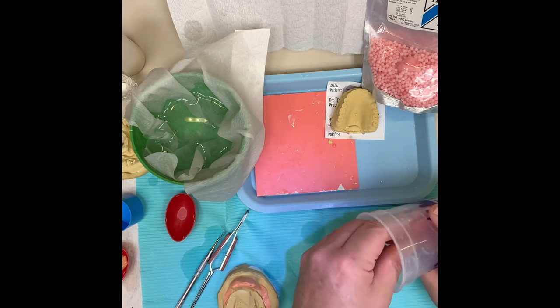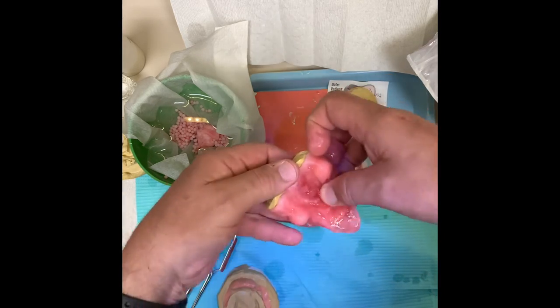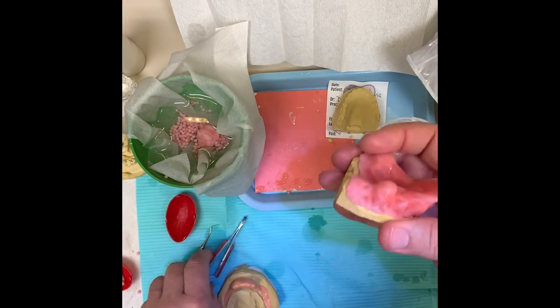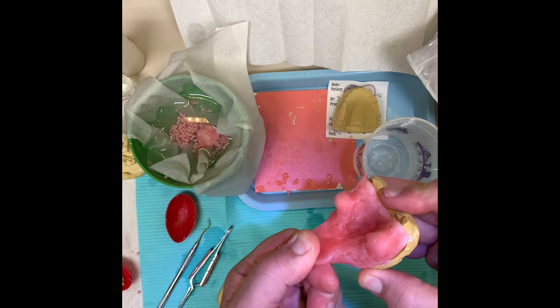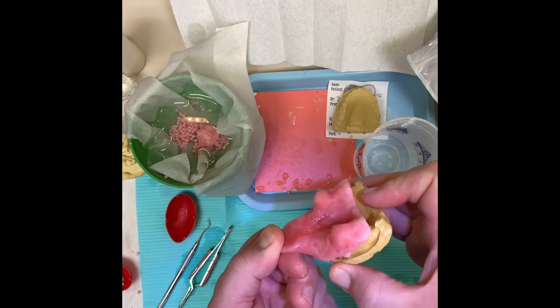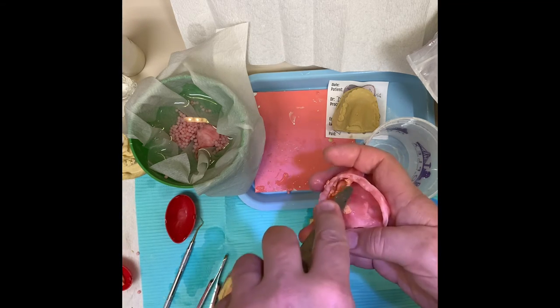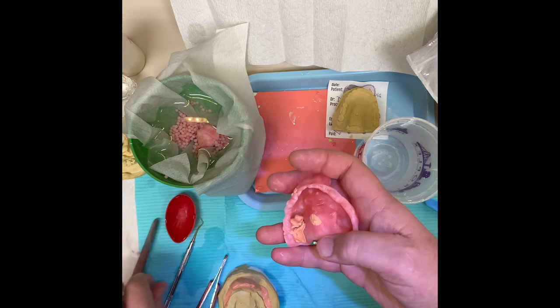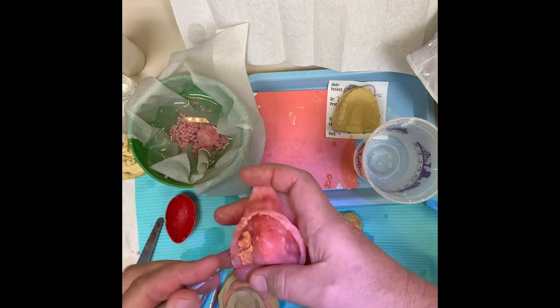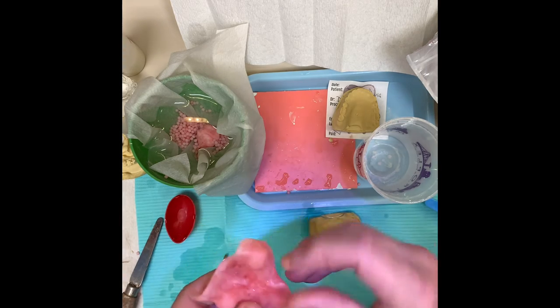If you want to hurry up the process, you can get some cold water and let it sit for a minute. You can see when you put it in cold water it hardens up pretty quick. If you've got a patient chairside and you're making one of these - which I've done multiple times because sometimes we forget - watch how I pull this off while it's still soft, just wiggle it off, and then peel out your silly putty with any kind of an instrument.